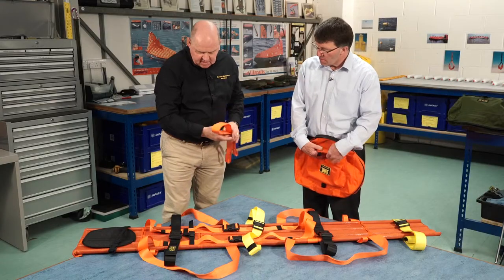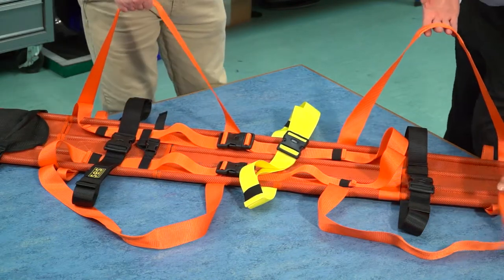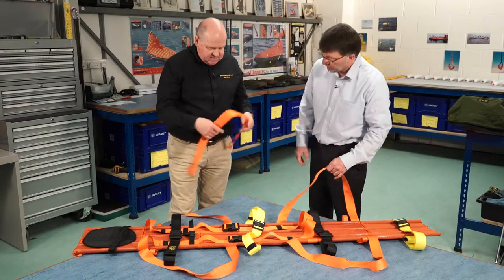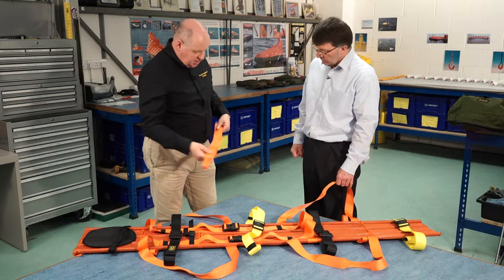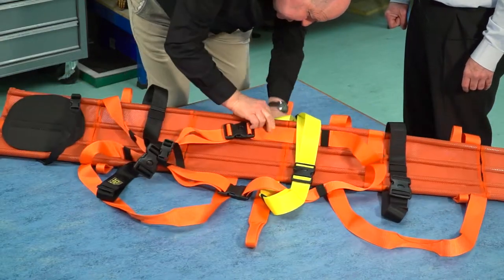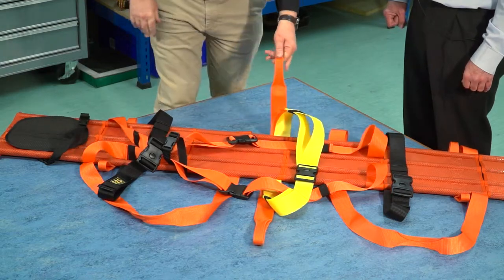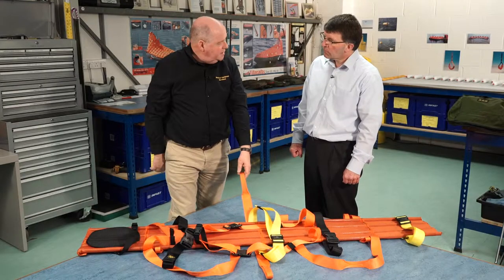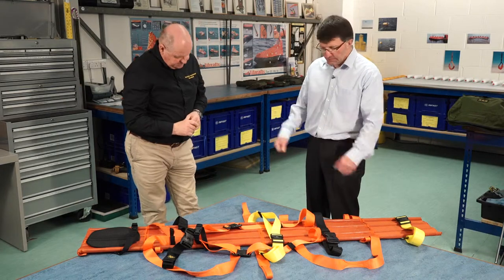As you can see, around the stretcher there are four lifting and carrying handles so you can carry with four people. But through extensive research and asking different rescue teams, some people prefer a six-man carry option. So what we've done — at a central point here — we've attached two Velcro patches and we secure a strap. This is strong enough to hold it in place and we can have six people carrying. So for those rescue teams that prefer a six-man lift, that's the option. Yes, indeed.